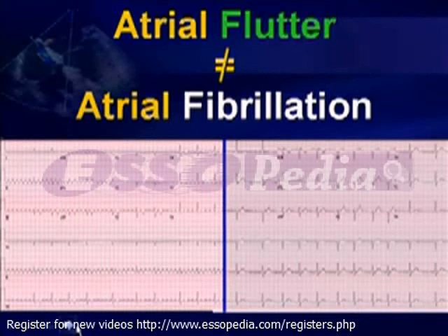Lastly, we must remind ourselves that in this instance, atrial flutter is not the same as atrial fibrillation. Because in atrial flutter, regardless of whether there's 2 to 1, 3 to 1, 4 to 1, or higher block, really no assessment of LV diastolic function can be made from the mitral inflow velocity, as ostensibly all LV filling is influenced by atrial contraction.